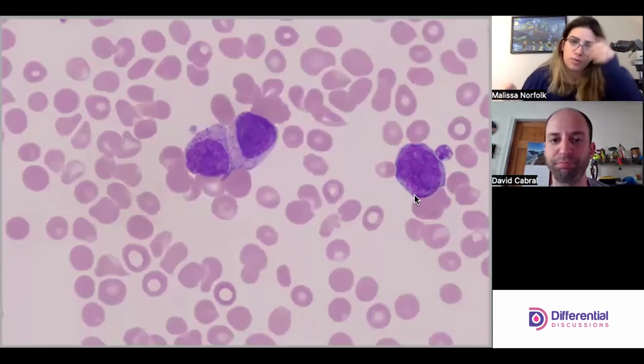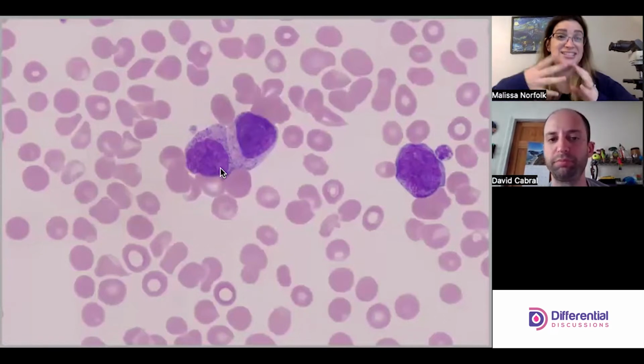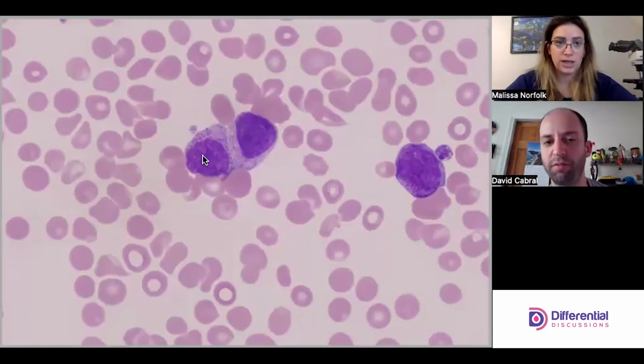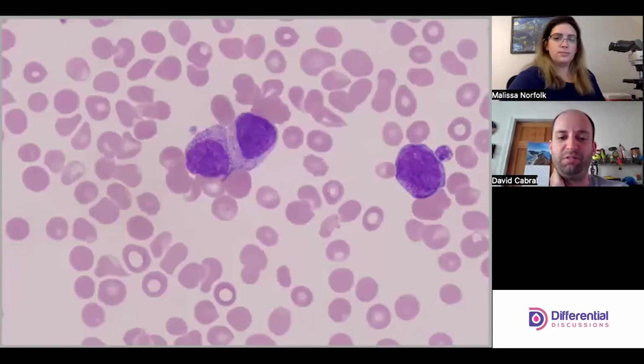Because I know it's a promyelo, I can look at these two and say they're more mature than the pro. So the next best is that they're myelos with the eccentrically placed nuclei, and you can see the chromatin pattern is more mature. This one may still have actual nucleoli, which myelos don't usually have. But again, we can have nuclear cytoplasmic asynchrony, meaning they're a little bit out of sync. Definitely. All right, let's see what else.